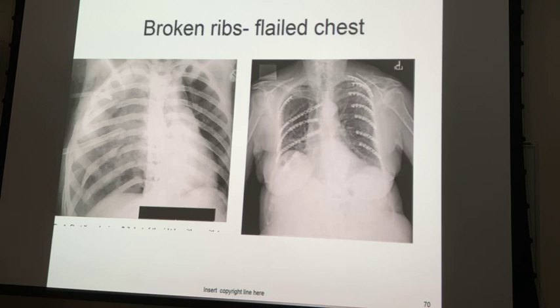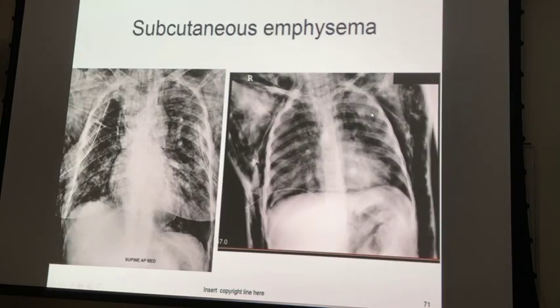in the thoracic cavity. I spent most of my career in surgery, and I never once saw them put plates and screws on ribs, not once. So this had to be a pretty severe case. It looks like somebody probably had osteoporosis, and chances are she wasn't going to heal, right? She just doesn't have the bone regeneration capability to heal those ribs, especially with them moving. So it had to be a pretty bad case, but clearly they do have plates and screws available if they need them. So that's your subcutaneous emphysema.